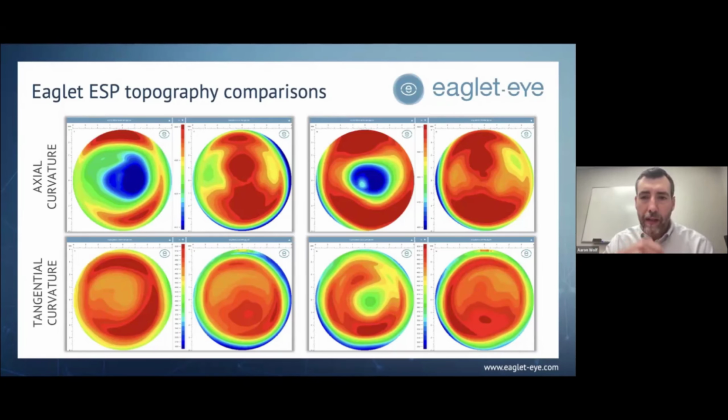So the benefit of that is if you do have a focalized area that's maybe not getting compressed as well, or maybe you had some punctate staining or anything that could actually be real, the computer and the software won't hide it. Okay. Now this is good and bad. The good is it's going to give you a more accurate, more precise representation of what you're actually seeing. The bad is it does require you to then be very careful about your tear film. You could be looking at an artifact, so then you would go back and you would review the quality of your maps. Okay, and these are excellent quality maps.